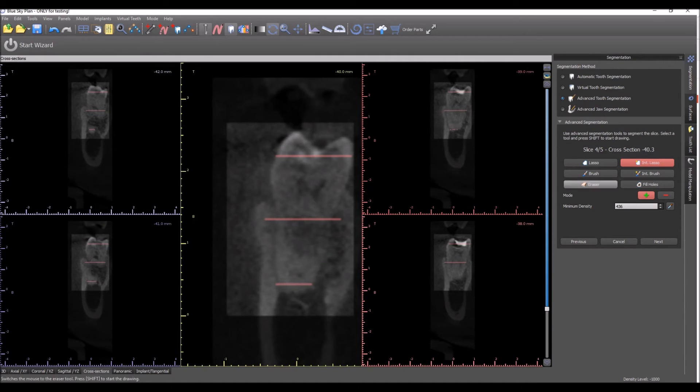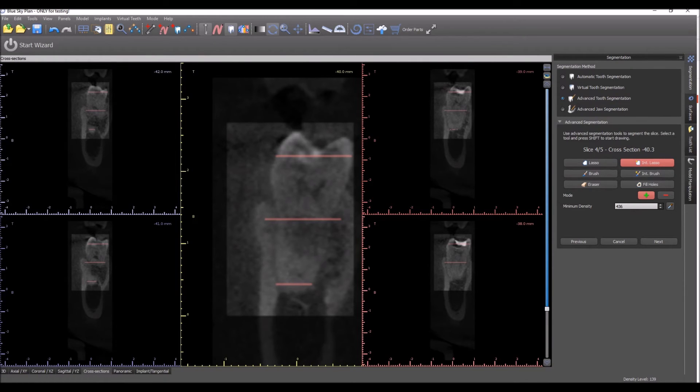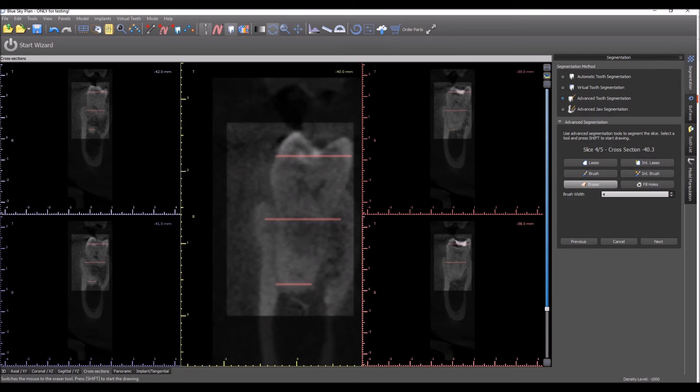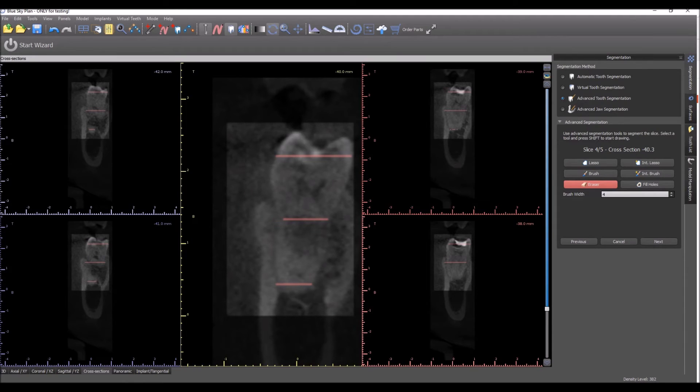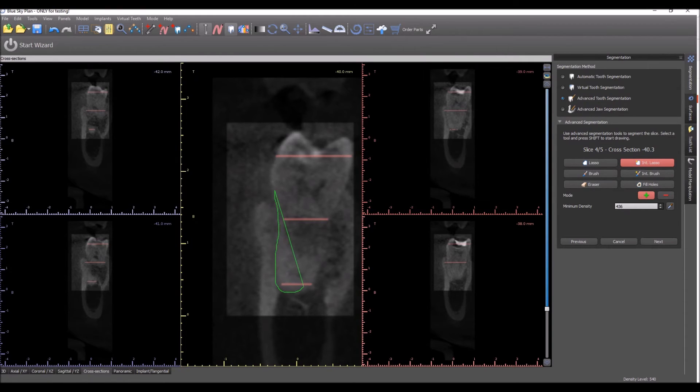Next, here we see with the pink stripes the areas that we've already indicated. So we actually see that we might have indicated too much in one of the slices. We'll use the eraser and just trim off part of the indicators over there. And let's go ahead with our Intelligent Lasso. We'll do the Lasso around the tooth.